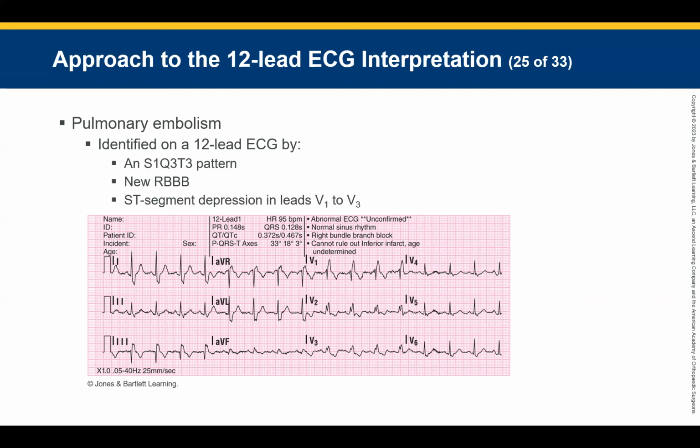You can sometimes see cardiac changes in something like a pulmonary embolism. But you're never going to remember that. Whatever that says, new right bundle, do you know if it's new? Nope. We aren't God. S1Q3T3 pattern. You're never going to remember this. So don't trip up on this.